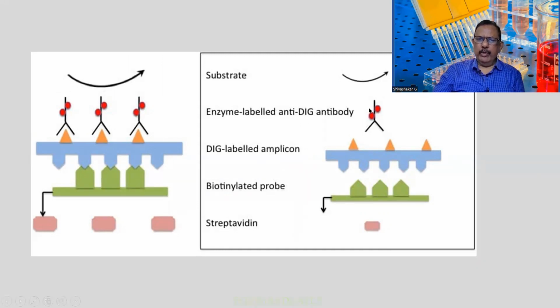Finally, there is an antibody and there is a substrate or a coloring substance. So this is how it happens. You find that the wells are being coated with the specific substance, then the antibody to the substrate, which can be identified and measured. As I mentioned earlier, it can be for a single sample, single antigen, or it can be for multiple.